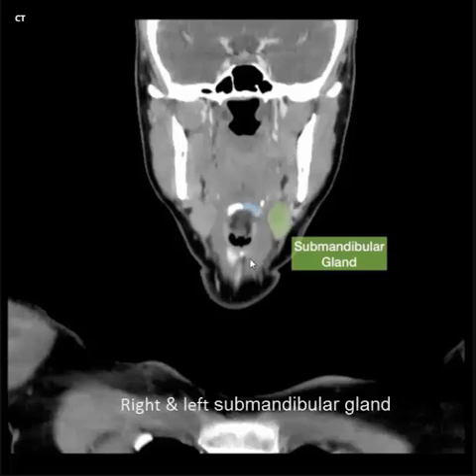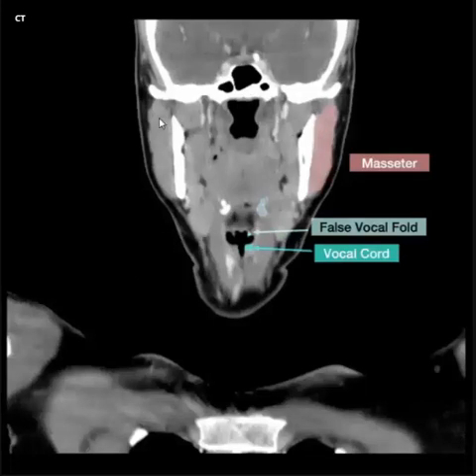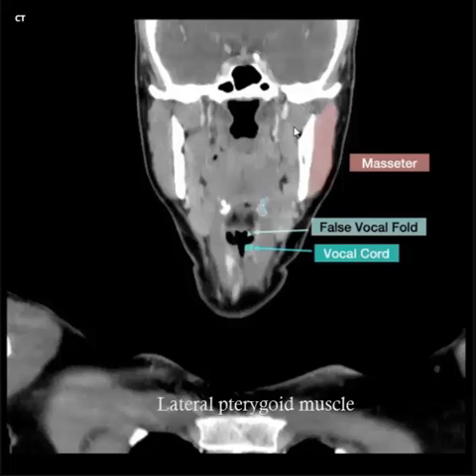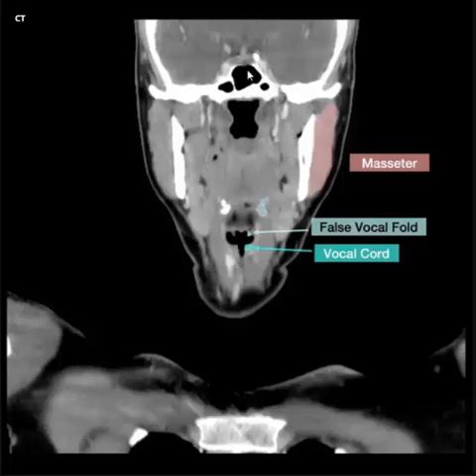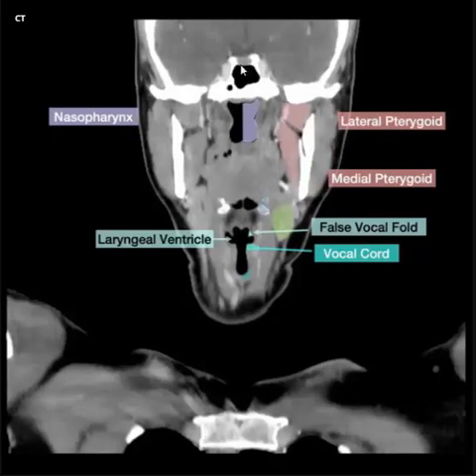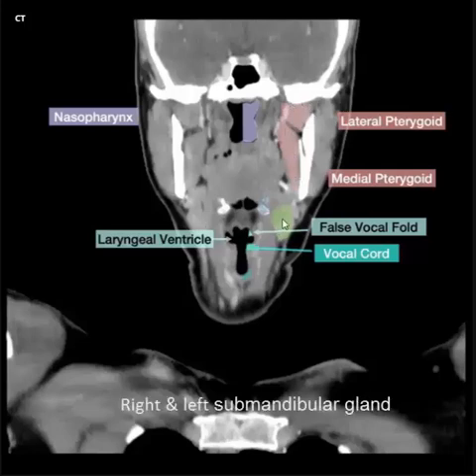Right and left submandibular gland. Right and left masseter muscle, right and left buccal space, lateral and medial pterygoid muscle. Sphenoid sinus, nasopharynx.